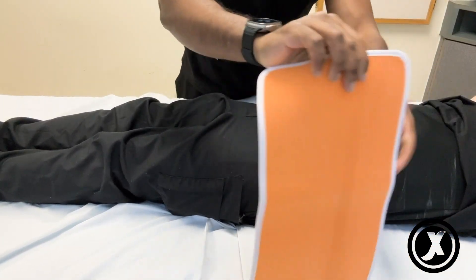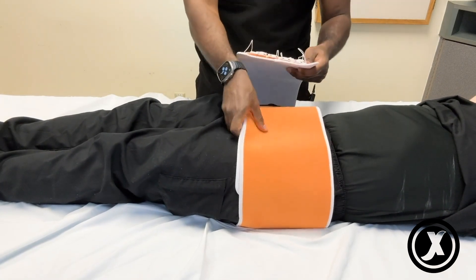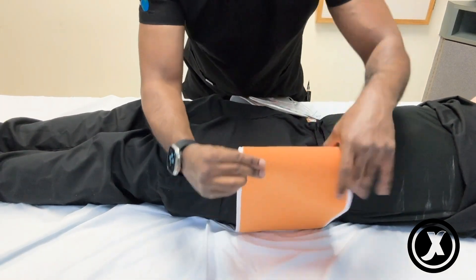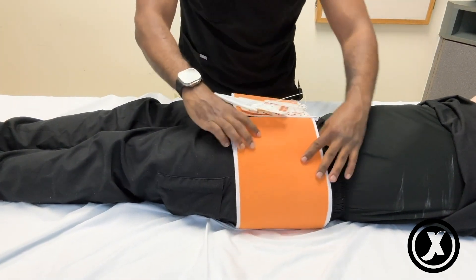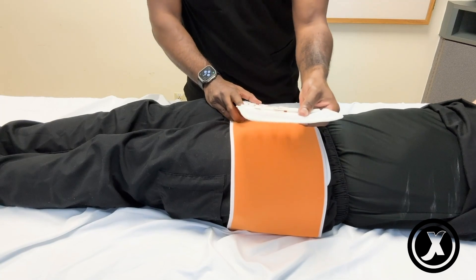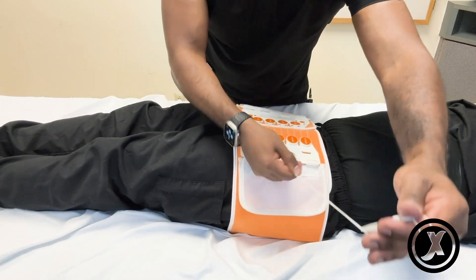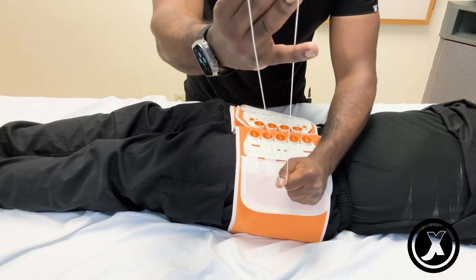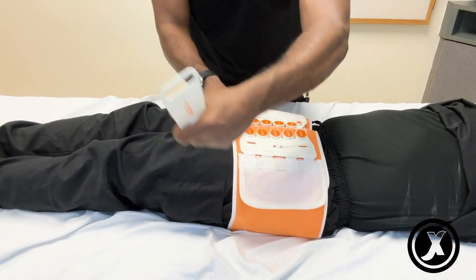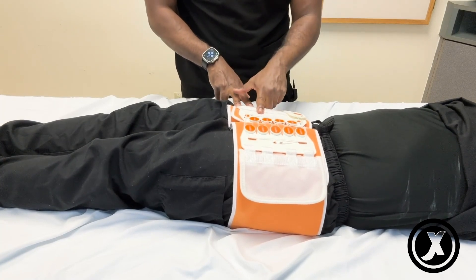And if one side feels longer than the other, what you can do is fold the sheet like this — fold it more until it's fixed. This has a Velcro, so the Velcro goes over here. And then with all the threads, it's easy to add in the resistance — just pull the threads together and use those safety knobs at the top.